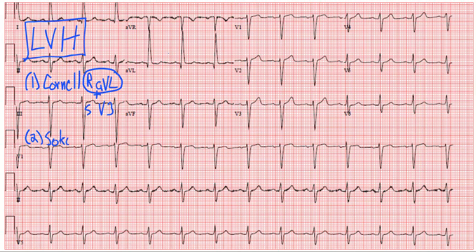Could have pronounced it wrong, probably did, but here we are. Sokolow Lyon criteria. And this looks at the S wave in V1 plus the R wave in V5 or V6.